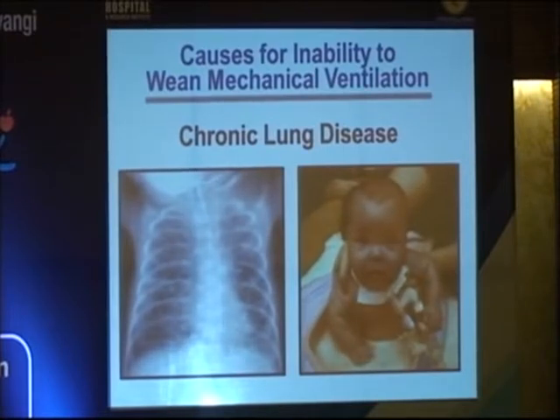Here is the X-ray: small cystic disease, hyperexpansion, so both restrictive and obstructive chronic lung disease. Here is, I would call, an anxious appearance, steroid facies. This poor kid is in a mess, and things are not going to get better for this child.